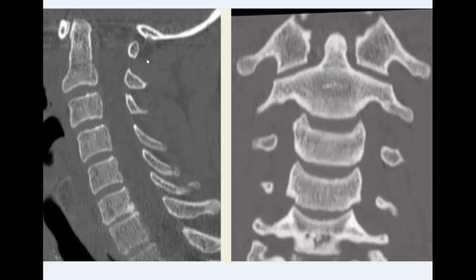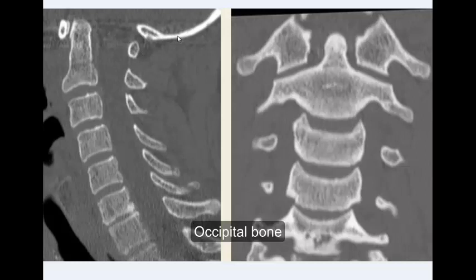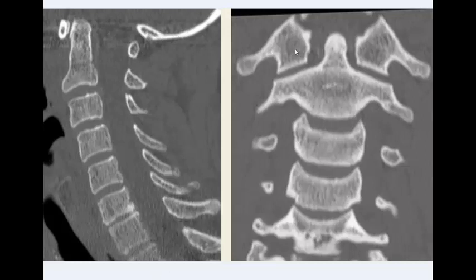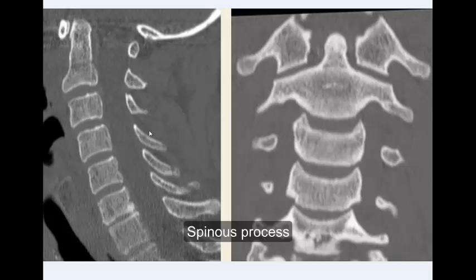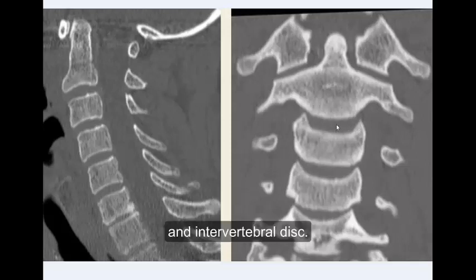On these reformatted images we can identify: the spinous process, anterior arch of C1, posterior arch of C1, occipital bone, lateral mass of C1, the dens, body of C2, spinous process of C2, uncinate process, and intervertebral discs.